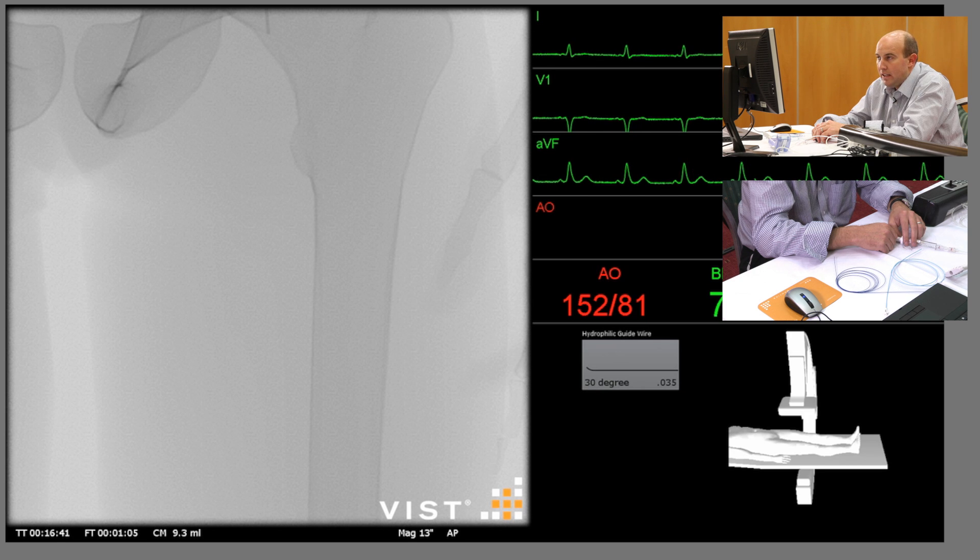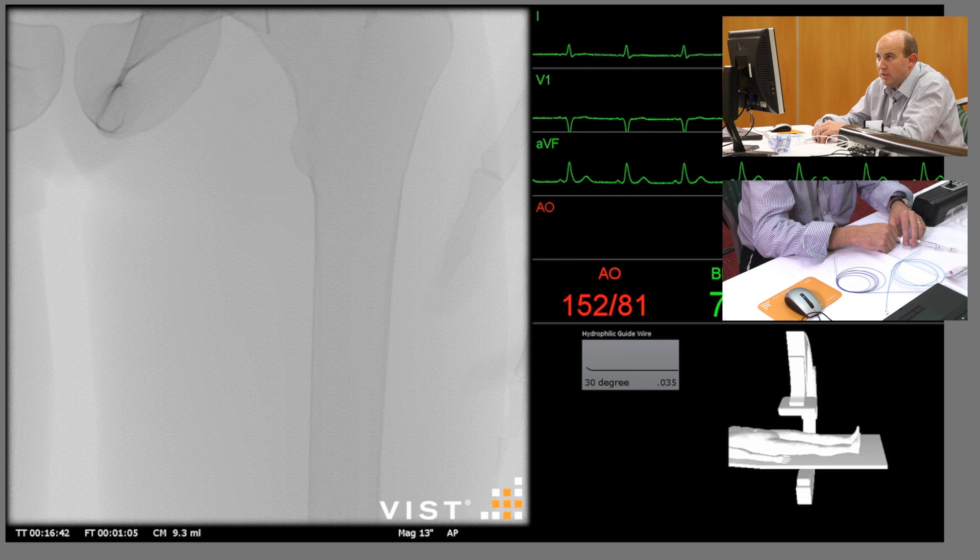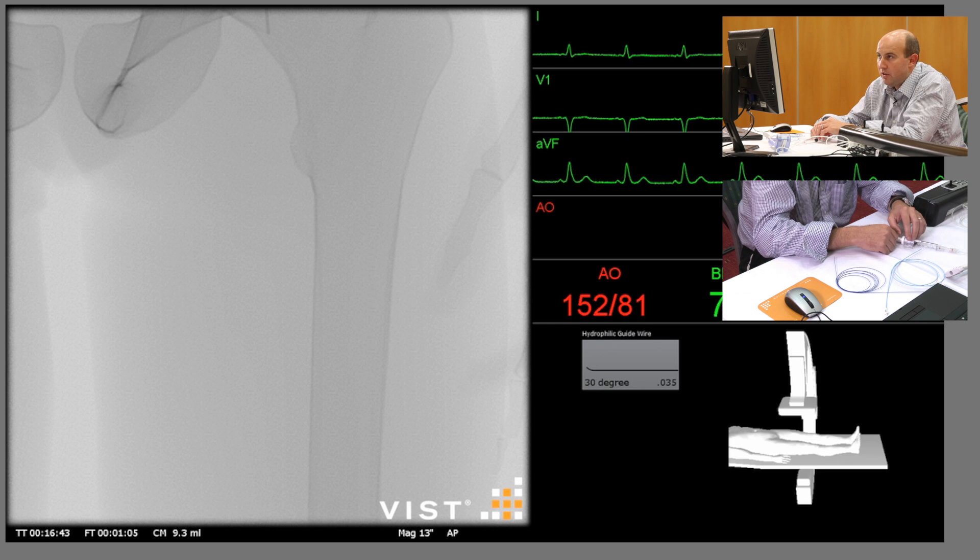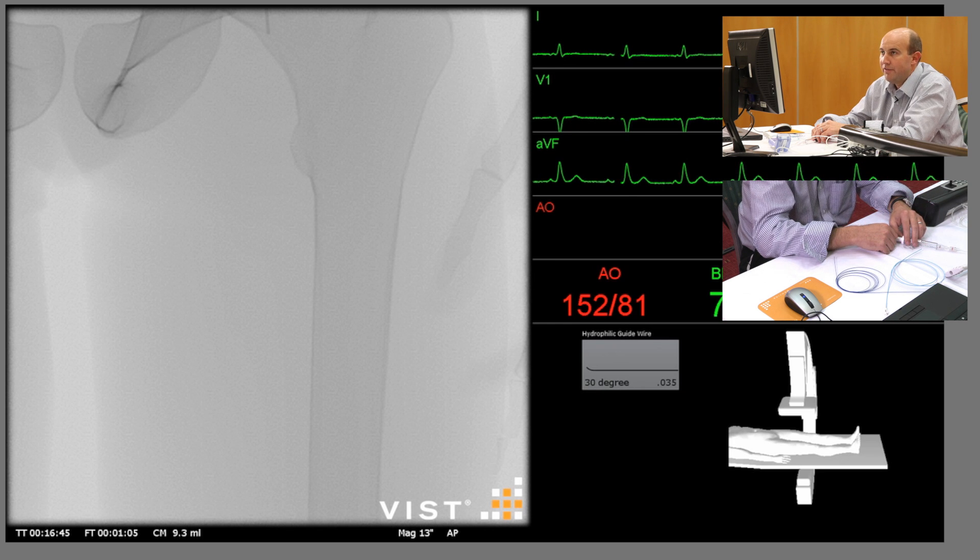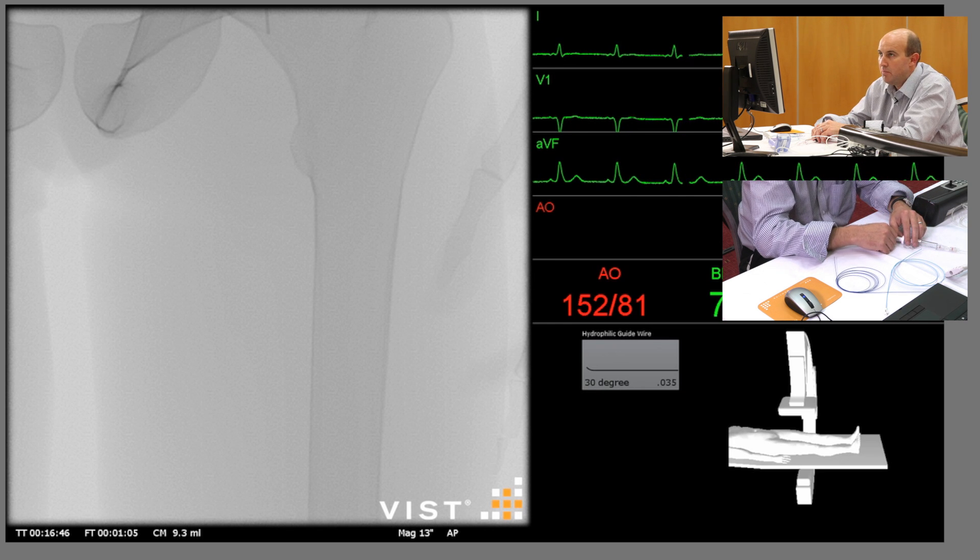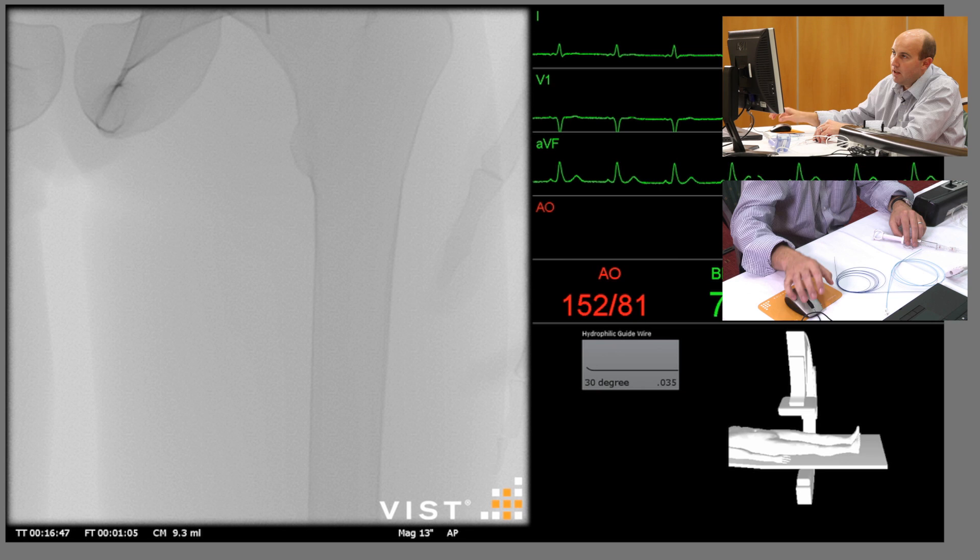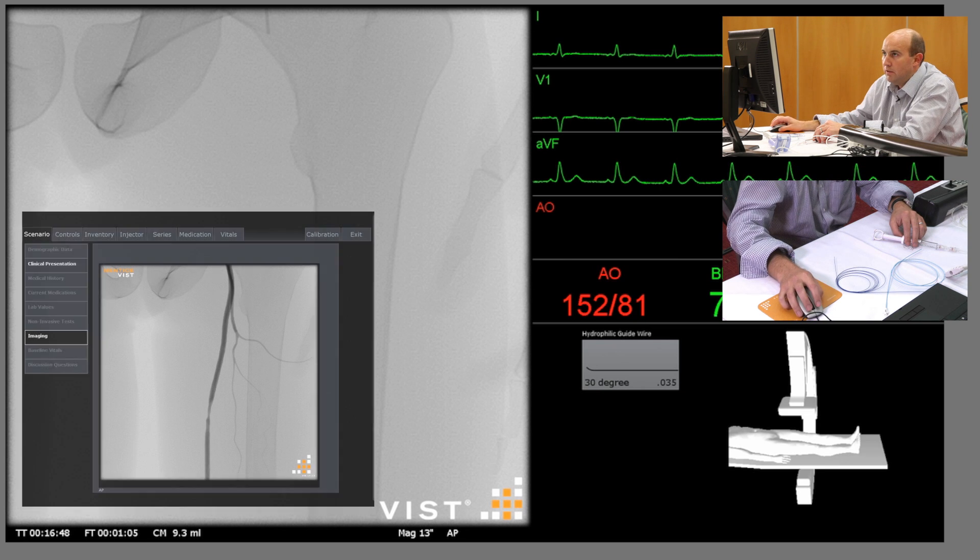So if we go to the inventory screen, we have the sheath and the puncture site noted here.